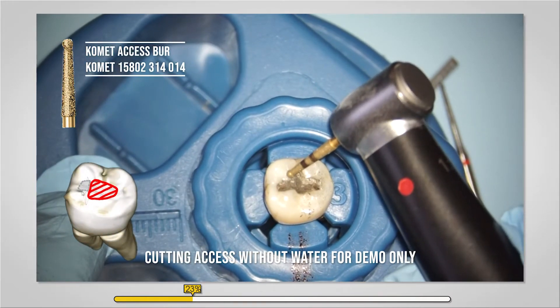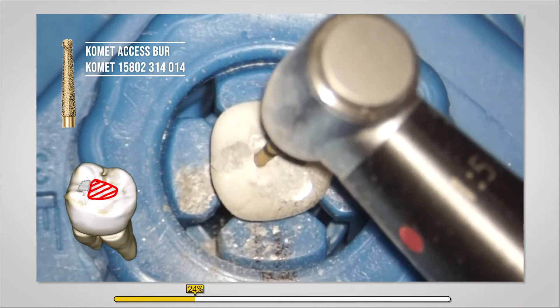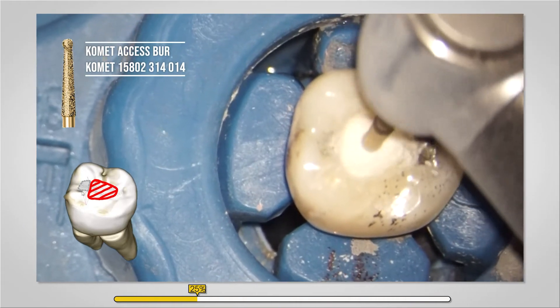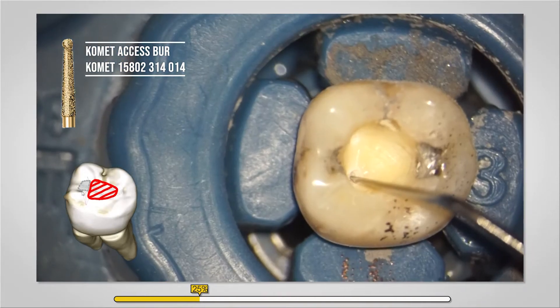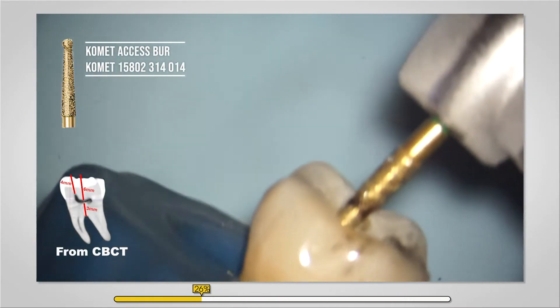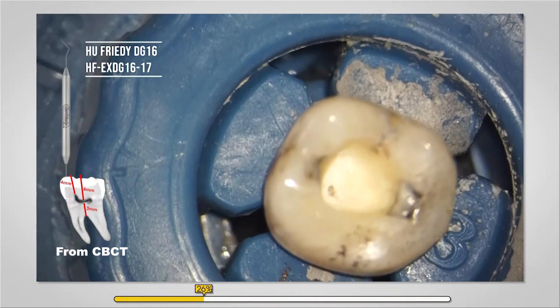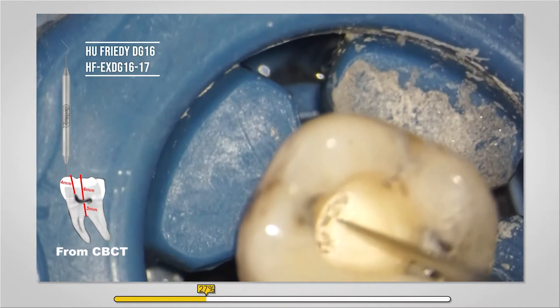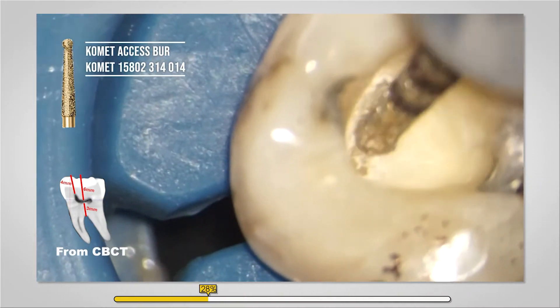Just removing that mesial amalgam. Notice the distal — I should have taken a little bit of distal amalgam out of this prep, which I did not. Removing these amalgams — I've probably got caries or some cracks underneath them. At the 4 millimeter mark we can start to see the pulp horns — sure enough, just a little bit over 4. Now I'm going to take this down to 6 and I should start unroofing the pulp chamber and moving into removing those calcifications. A really sharp DG16 is wonderful for doing this kind of prep, just scratching away to confirm we're on the right path. I see a detached endolith down there that we're just going to unroof completely and remove.